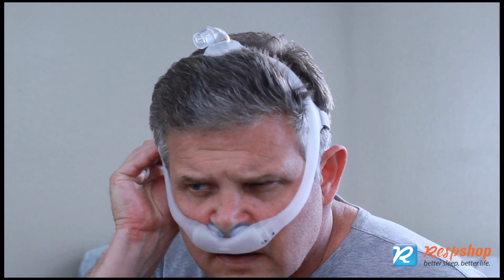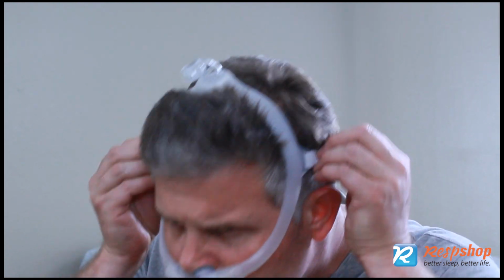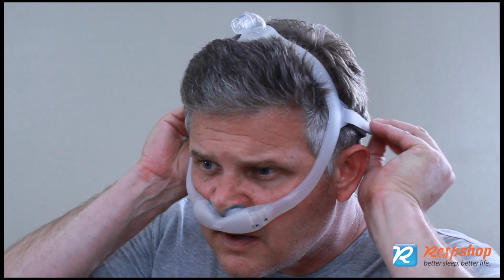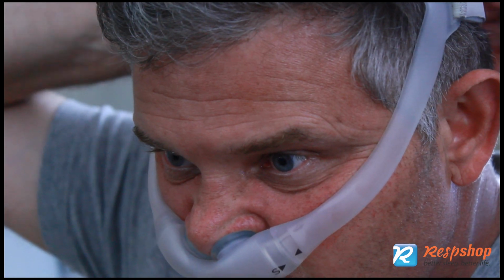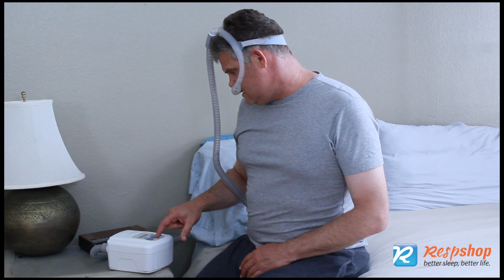The first thing many people do to fix a mask leak is tighten the headgear. But that should be an action of last resort. Overtightened headgear leads to sore skin and often worsens the leak. Keep in mind that some degree of leak is okay.